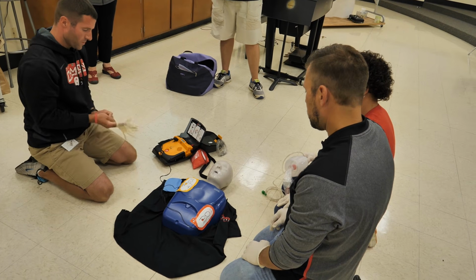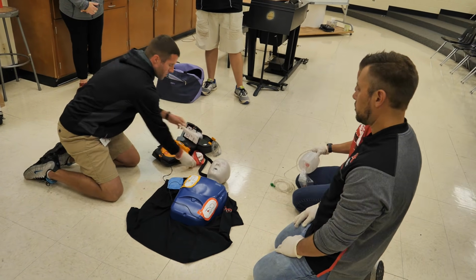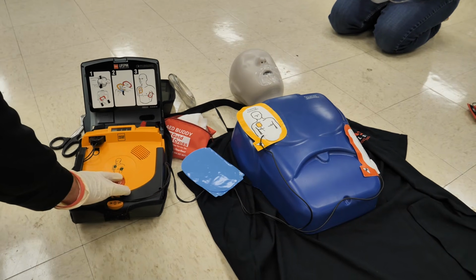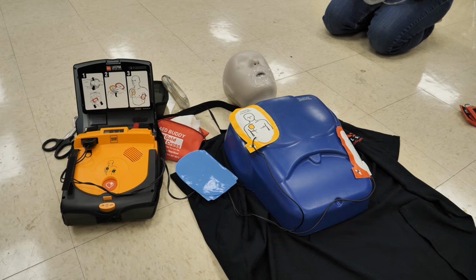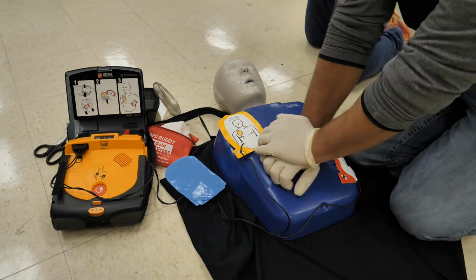Evaluating heart rhythm. Everybody back up, back up. Stand by. Preparing to shock. Everybody back up, we're gonna shock. Everyone clear. Press flashing button. Shock delivered. Provide chest compressions and rescue breaths.